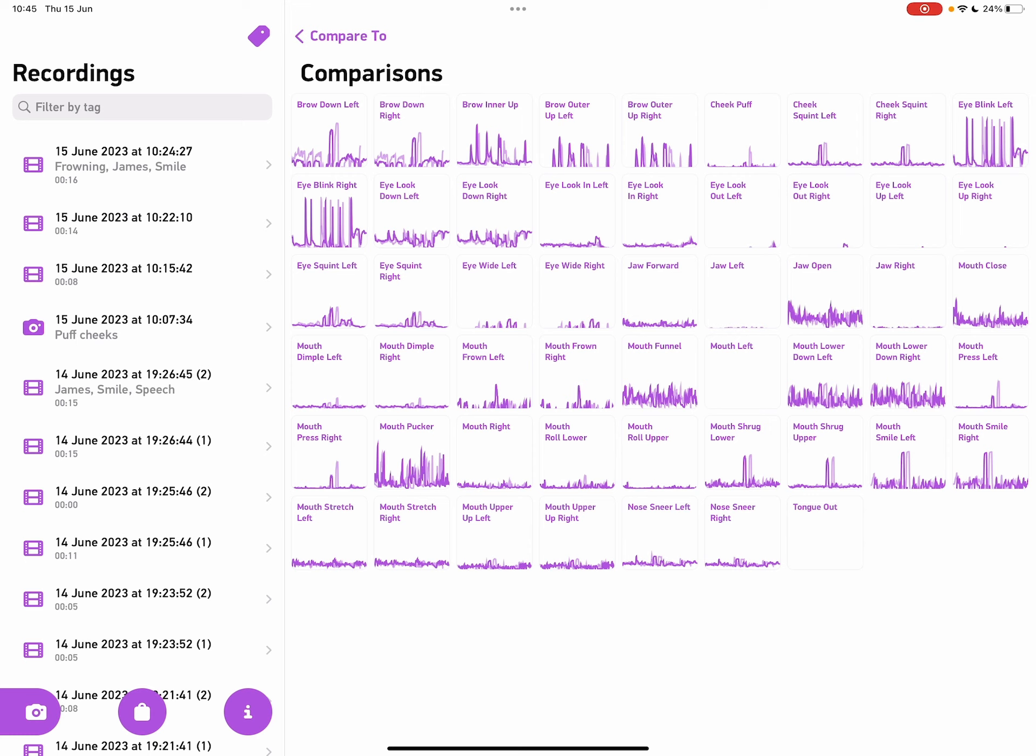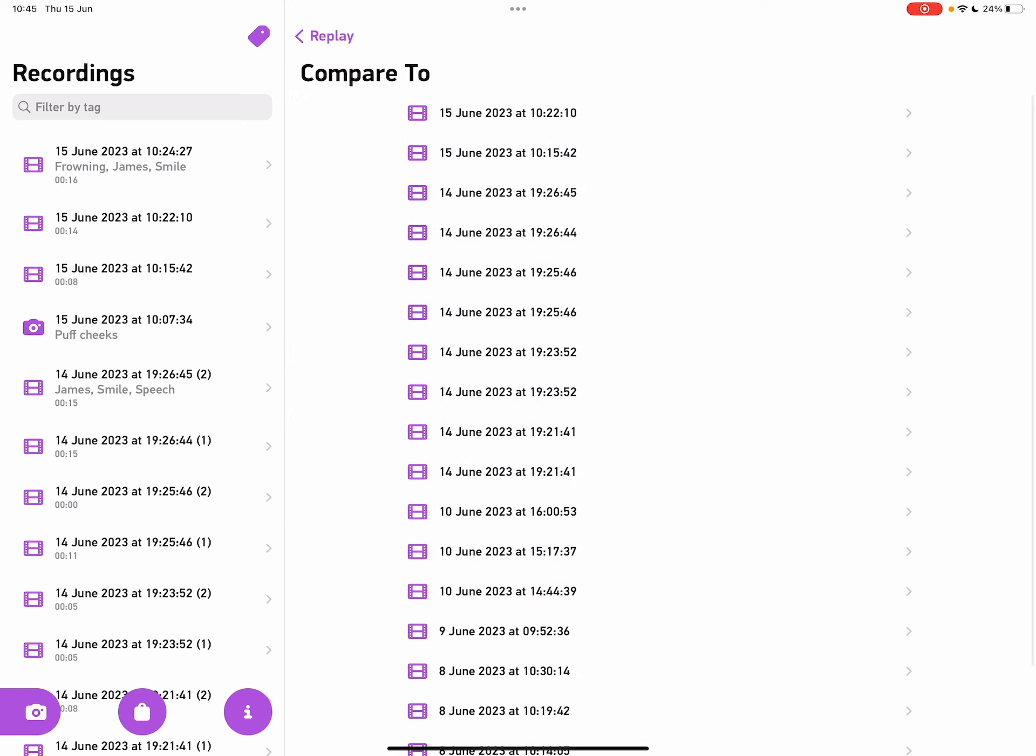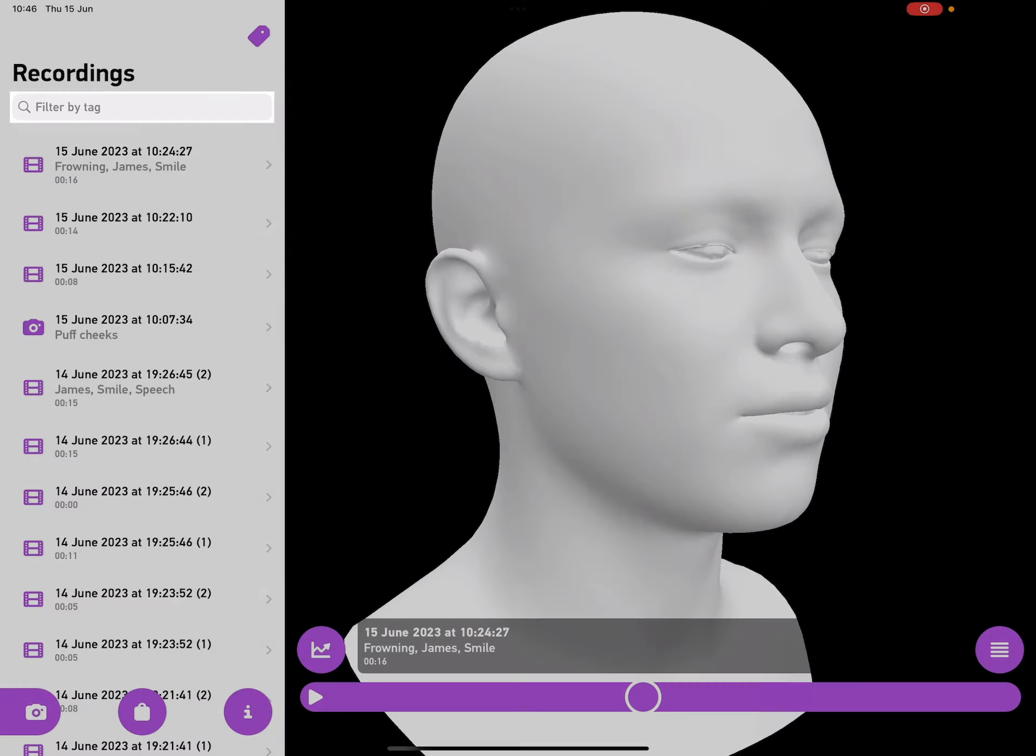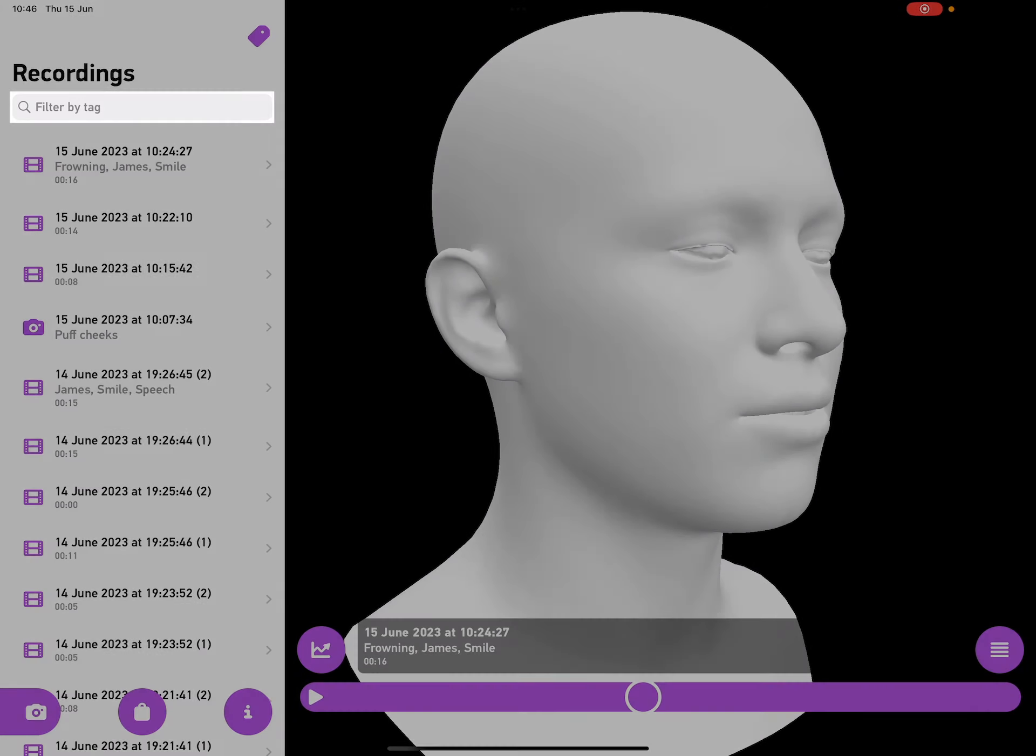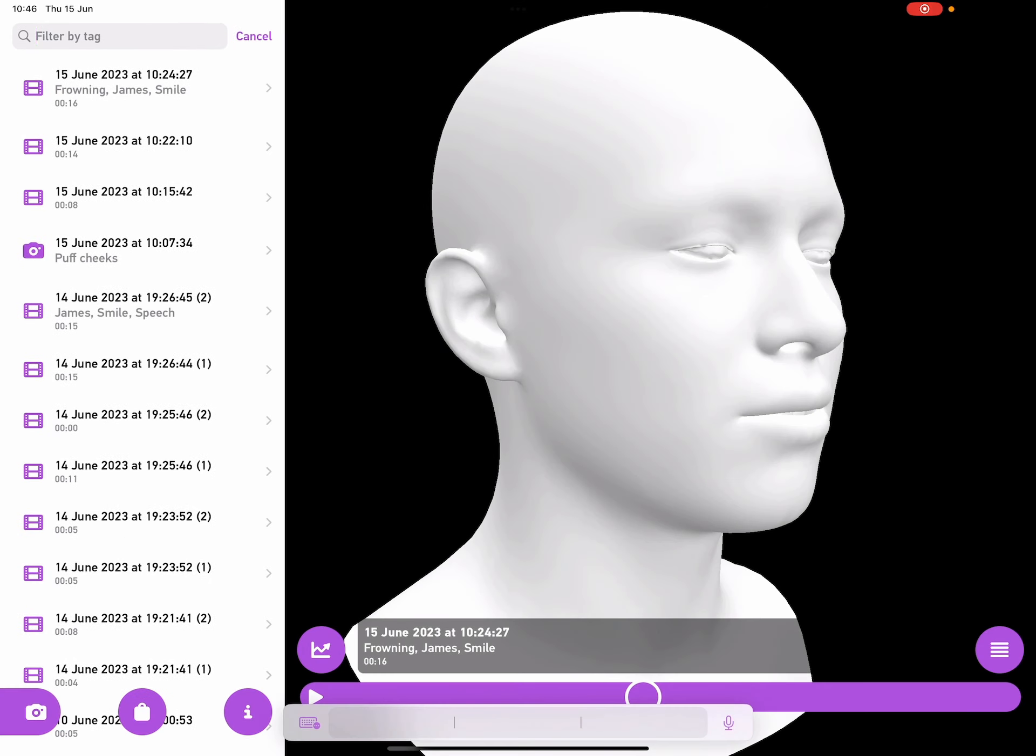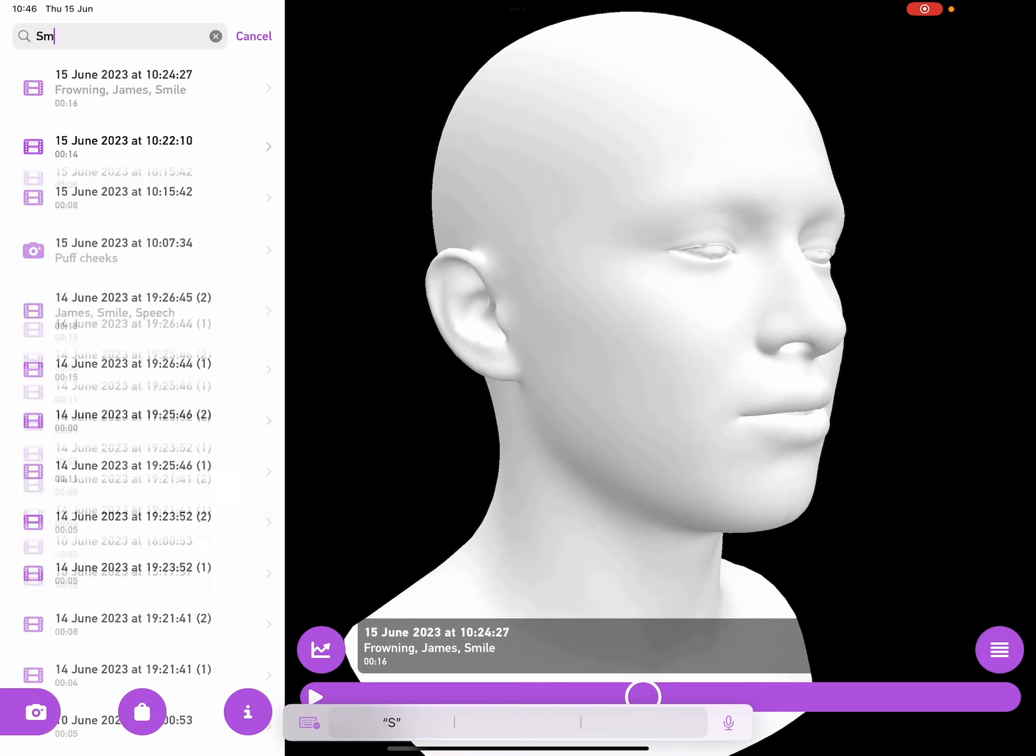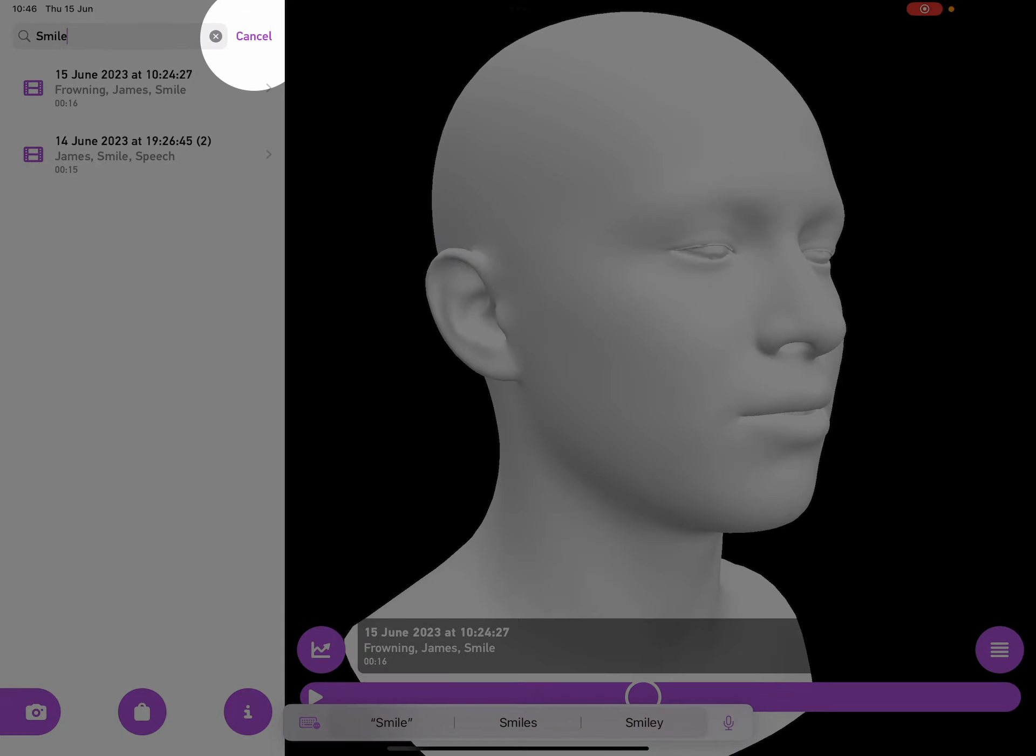Let's go back to the replay. Now in my recordings list on the left, I can tap to search in the top, so I can type in smile, and it shows me all the recordings that are tagged with smile. I can tap on cancel to get rid of that.